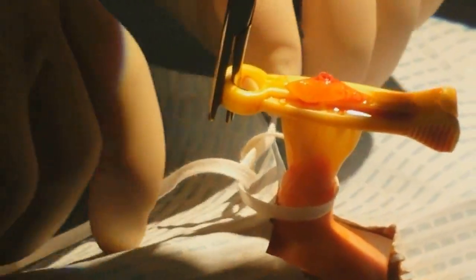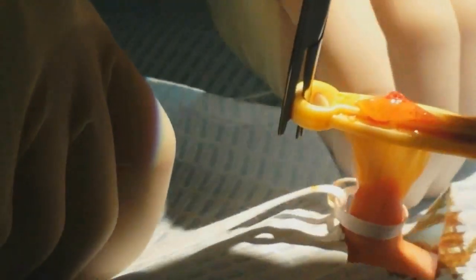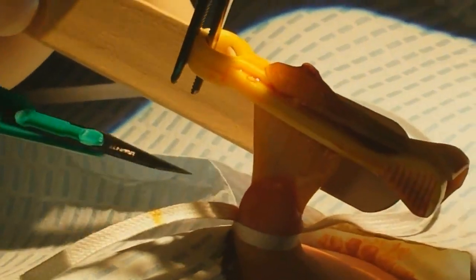I'm now tying an umbilical tie. The goal is to achieve hemostasis once I cut this cord stump. I'm going to cut below the clamp in one pressing, moving motion. I'm going to have my nurse assistant just pull directly out. On three — one, two, three. There you go.